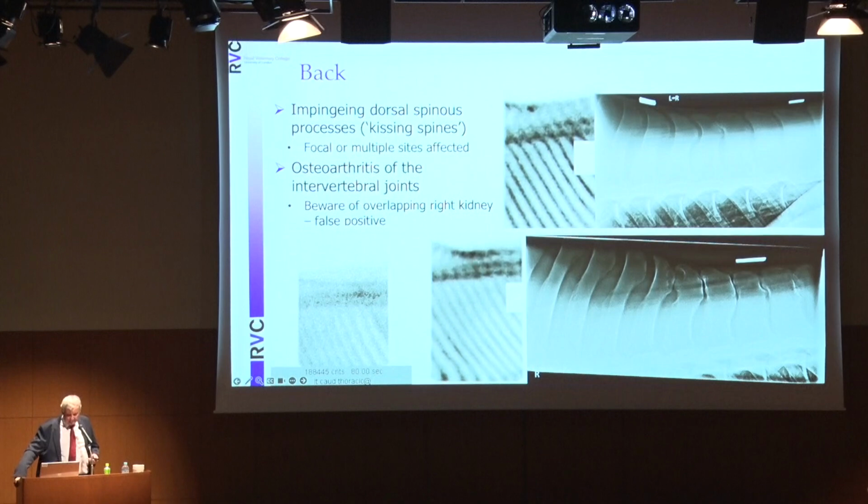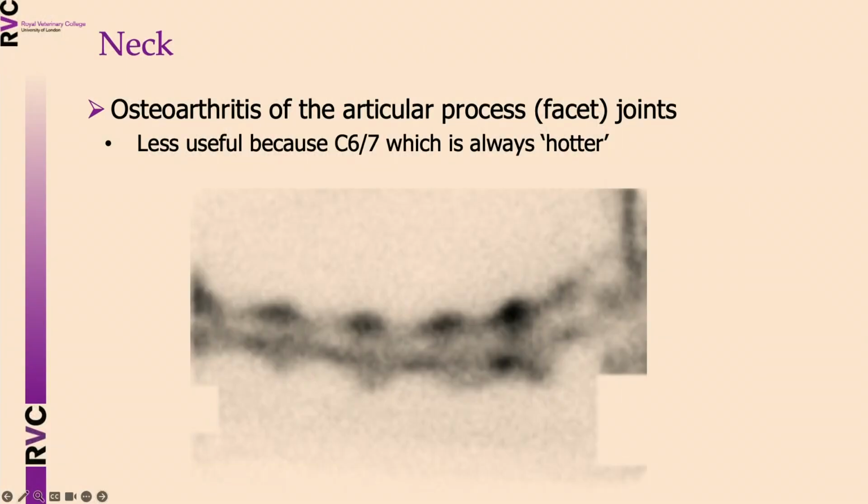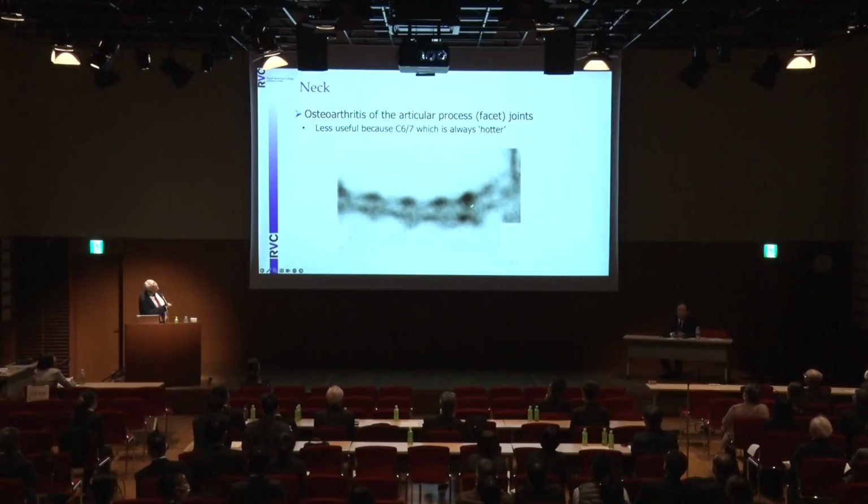This is the same problem with the neck because we are looking often for areas of osteoarthritis involving the facet joints.